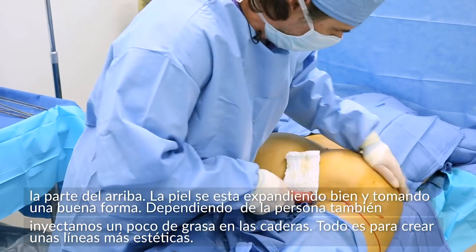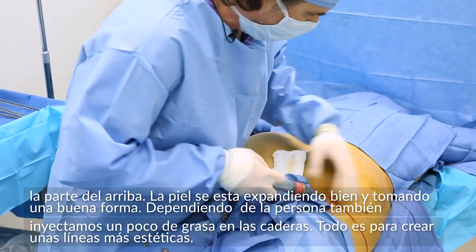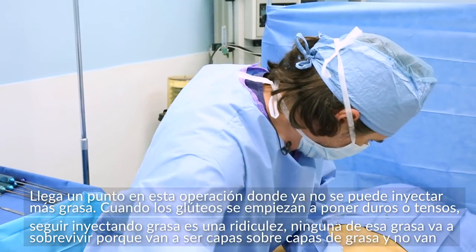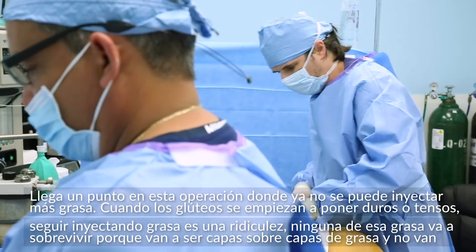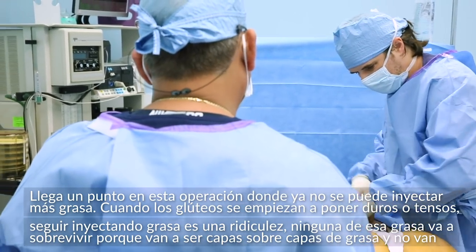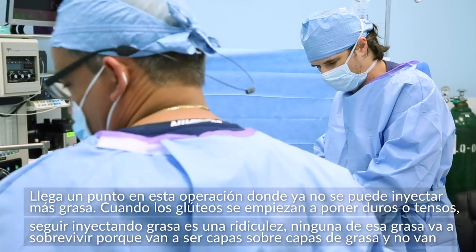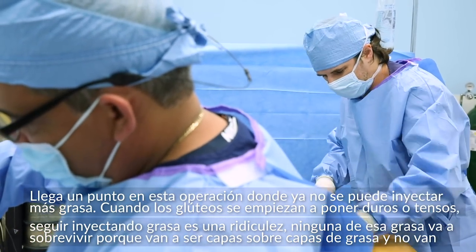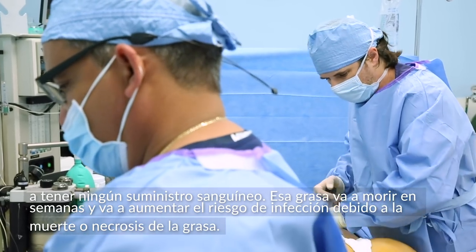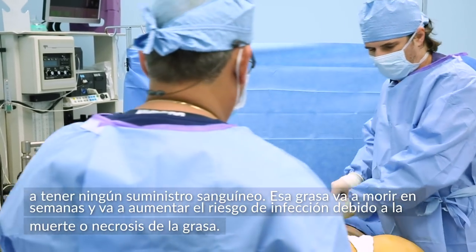I also inject some fat into the hips depending on the person. There are some indentations, and everything is about creating the aesthetic line. There comes a point when doing this operation that you can't inject any more fat — when the buttock starts getting too tight and too tense, injecting more fat is just ludicrous. None of that fat is going to survive because it's just fat layered on top of fat — it won't get any blood supply, it's just going to die over the ensuing couple of weeks. And you're increasing your risk of infection secondary to fat necrosis.